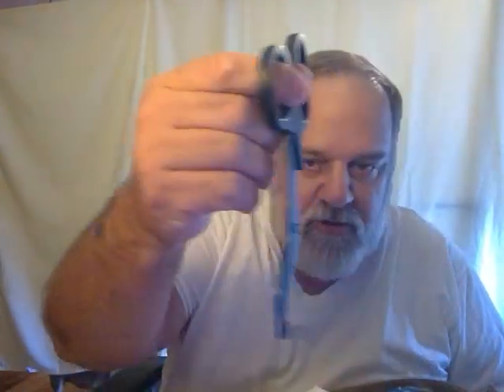So you've got a pair of shears. You've got a bandage sling, or triangle bandage sling, like you put it over your head and shoulders and put your arm in it, because you need to keep your arm up. Got one of those in here. One pair of gloves, no, 2 pair of gloves.